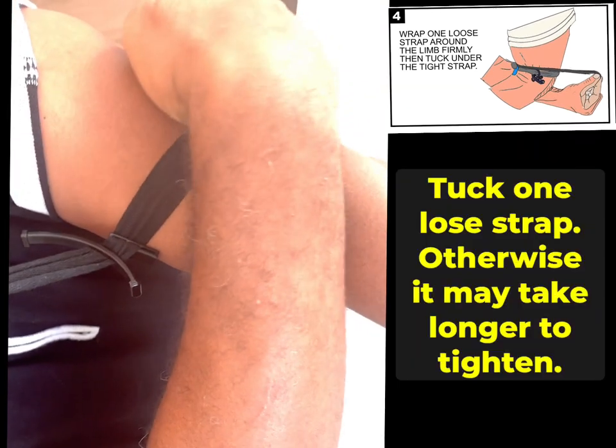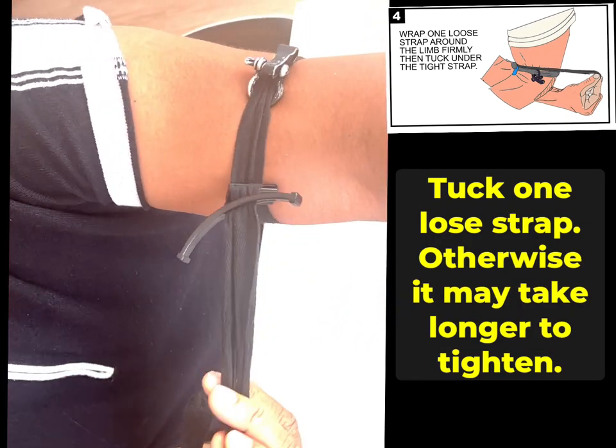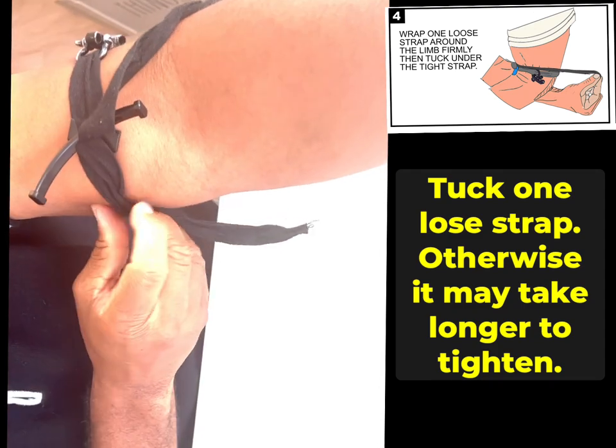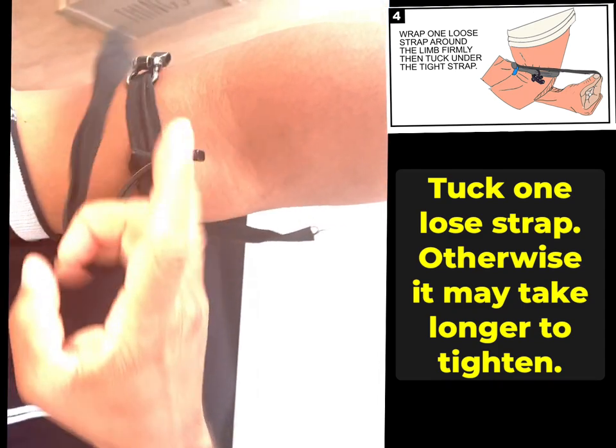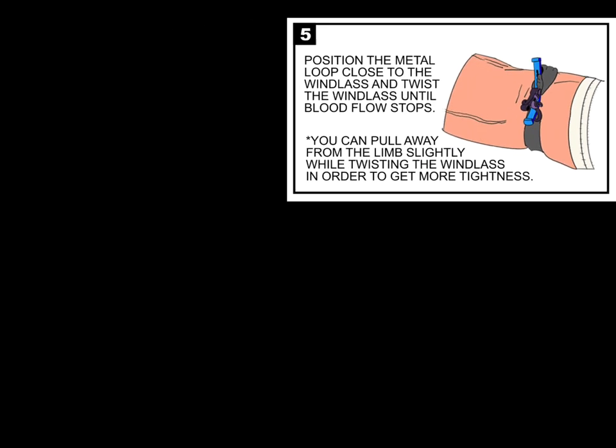It doesn't matter which side. I can just tuck it — I don't have to tuck it far, that's fine. I just want to tuck one. There's a reason for that: if you don't tuck one, you can still tighten it, but it'll take longer.